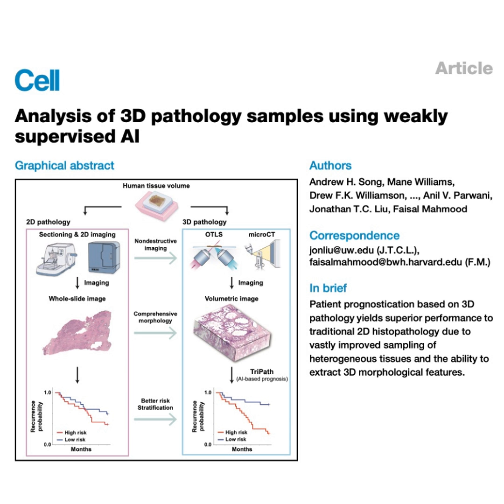So that's where we're jumping in today, this inadequacy of 2D. Precisely. And we're exploring a potential solution called TriPath. It's a deep learning platform, AI basically, but it's designed to sidestep that 2D limitation entirely. Okay. TriPath doesn't care about individual slices so much. Its whole goal is to analyze the entire 3D tissue volume. A whole block. The whole block.